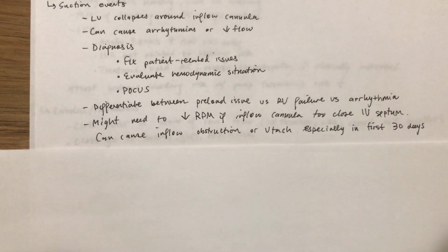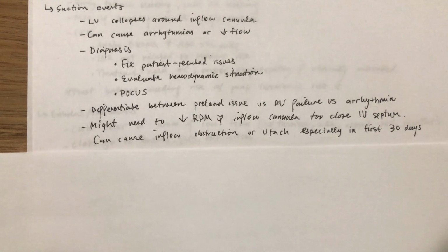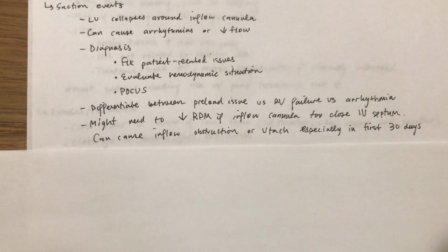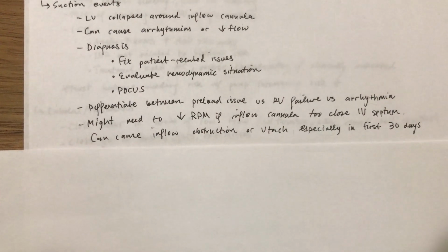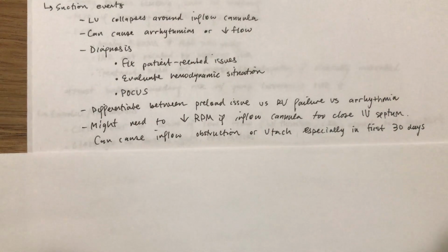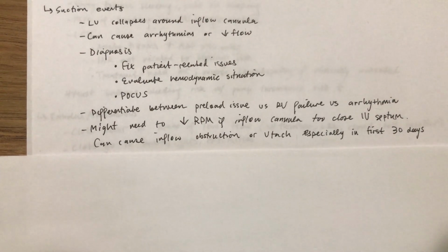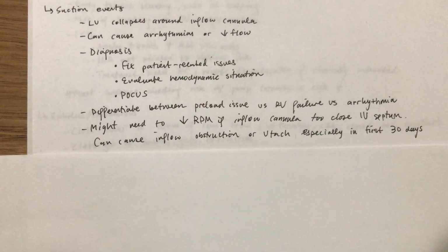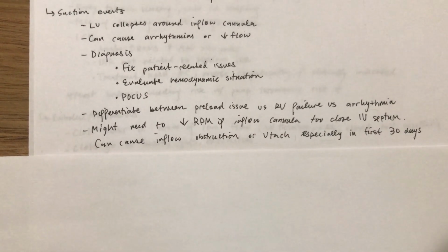Is it a patient issue? Are they sedated? Are they in pain? Or is it a hemodynamic issue? Did the day team dry them out and accidentally sabotage you? And the best way to check this is to do ultrasound, look at the left ventricle, and see what's going on. It's generally a pretty easy problem to solve once you use ultrasound.